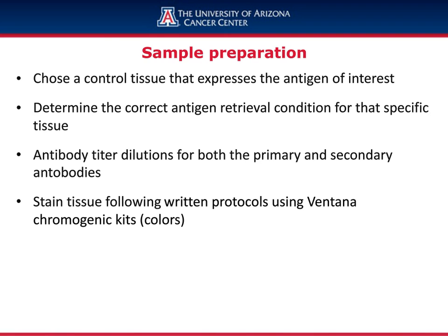My next step, which is very important, is I have to determine an antibody titer.